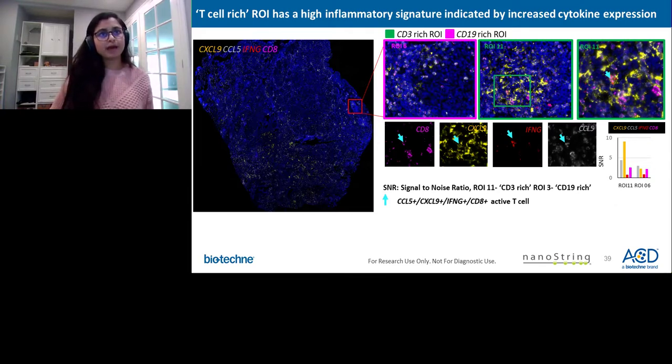Interestingly, the expression pattern seen here using RNAscope was concordant with what we observed with the GeoMx DSP analysis, again showing that these 2 assays are concordant and show similar expression analysis. RNAscope also allows single cell and single molecule detection, as observed here in these individual channel panels.